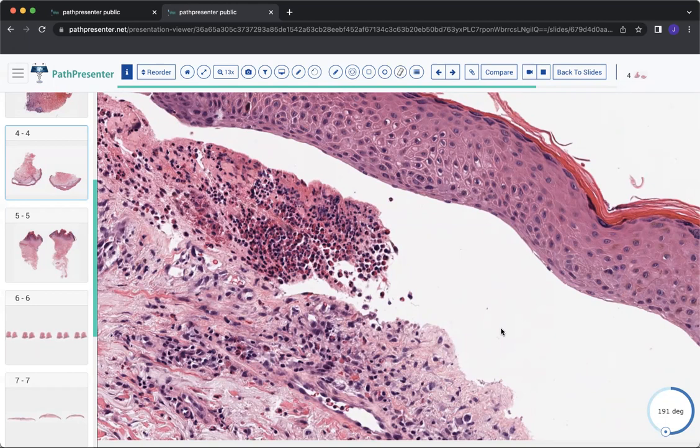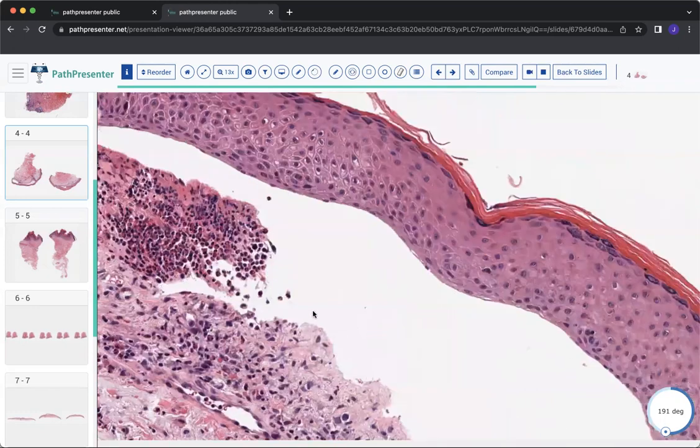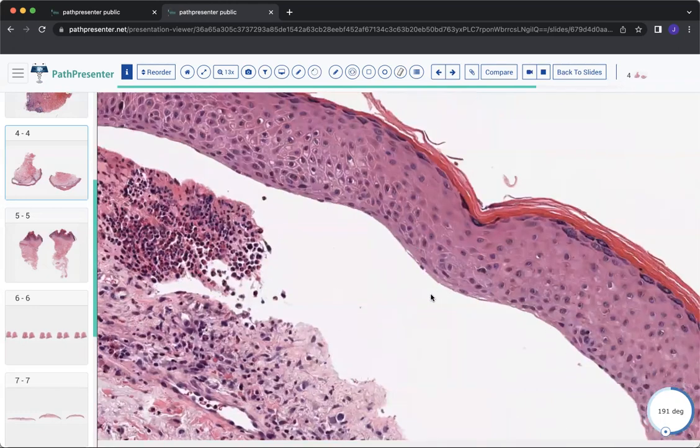Again, you're doing salt split skin on something that has not formed a bulla, so that's going to be a perilesional piece of skin. But when you do the DIF on that, you're going to find that the immunoreactants will go to the roof in bullous pemphigoid because, as I said, the split causes the bullous pemphigoid antigen to go higher. So you would see it decorating the roof of the blister. And if it were epidermolysis bullosa acquisita, you would see it decorating the floor of the blister.